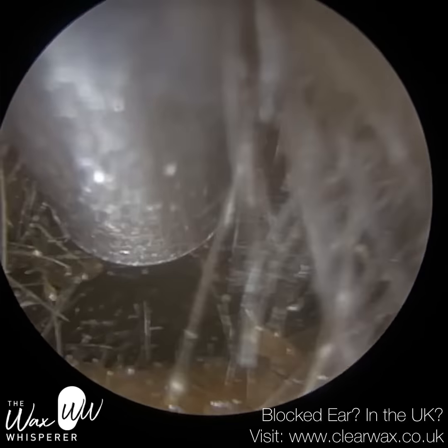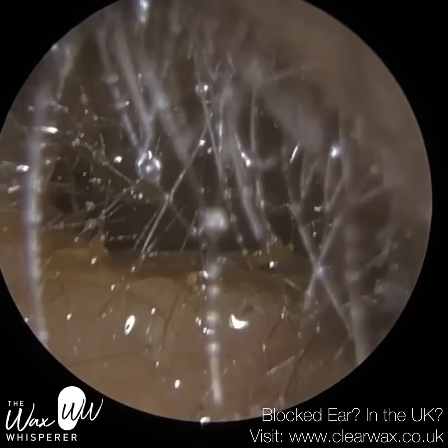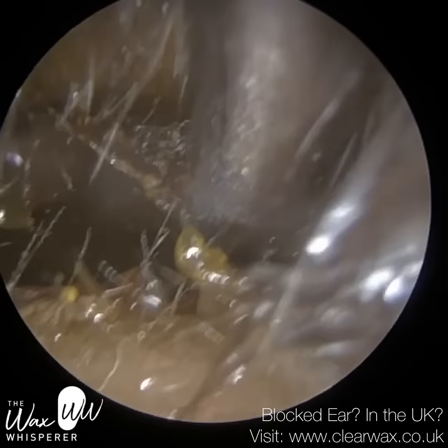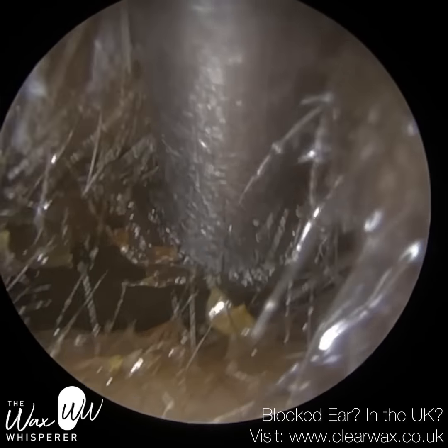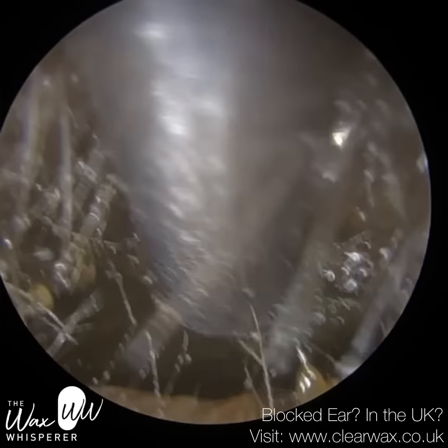As you can see this wax is quite dark so it's been there for a while — it's oxidized. Freshly secreted wax is more of an orangey, light brown color, and as the wax matures it ages and oxidizes and it gets darker in color.